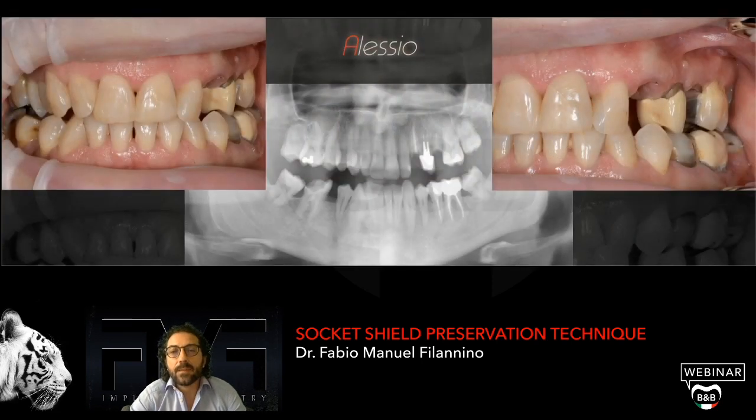Another case that I want to show you is Alessio, and Alessio had to extract the three roots in the 23, 24, and 25 positions, and his treatment plan was not to insert any immediate loading. He only came to the office to do the extraction, and I had to do only the surgery.